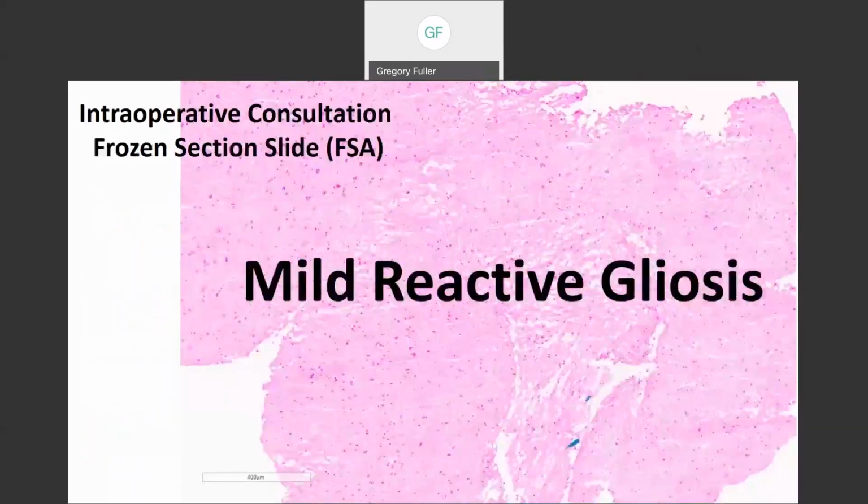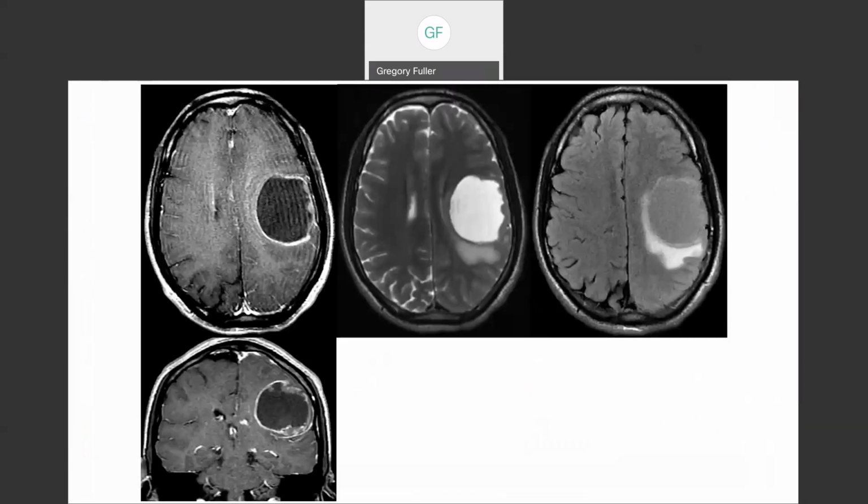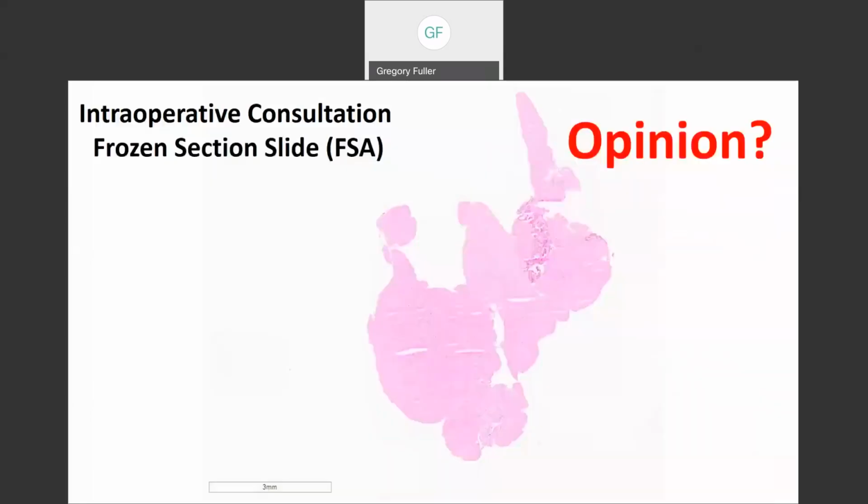I'm going to back up, right here to the original imaging. This is so important. This is cystic glioblastoma. It looks very similar, including the very minimal to almost no vasogenic edema, to a circumscribed tumor, cyst, mural nodule, et cetera. Okay, that's a point I wanted to make.